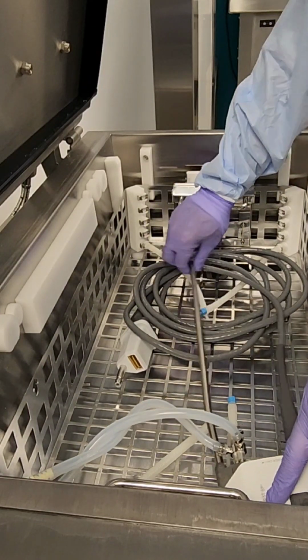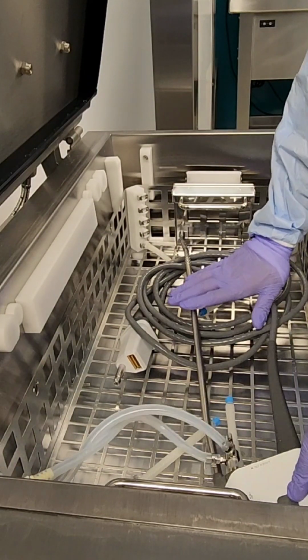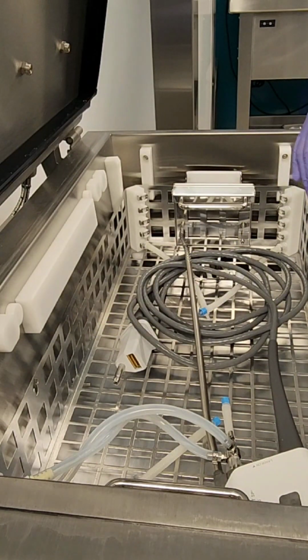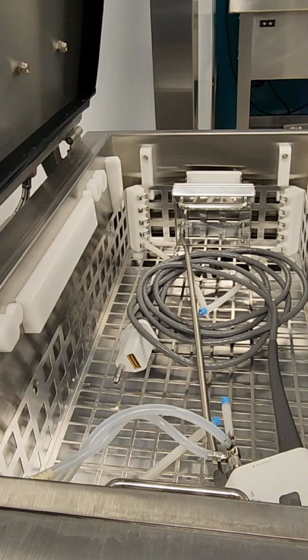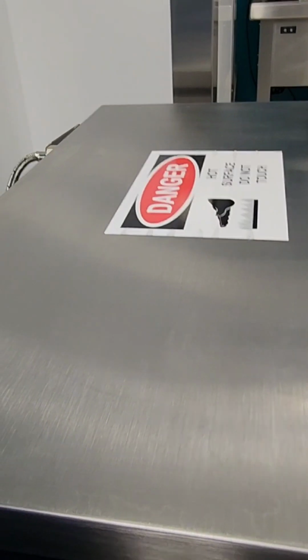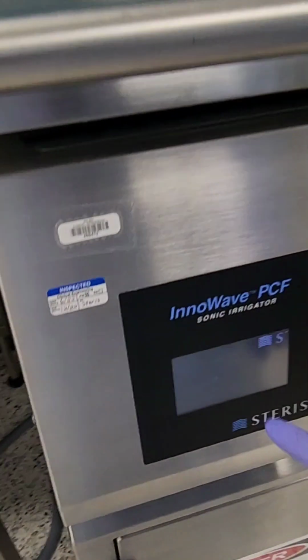Okay, always ensure that everything is secure. Some ultrasonics have brackets that you can place the scope on, the camera on, so it doesn't move around or fray around. But if you position it correctly underneath and on top of the cords, you should have no issues.